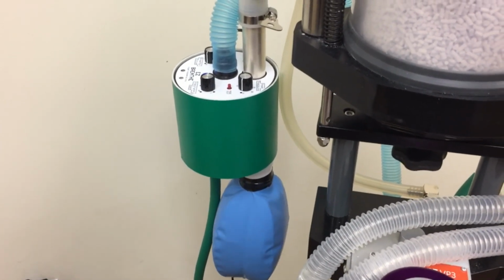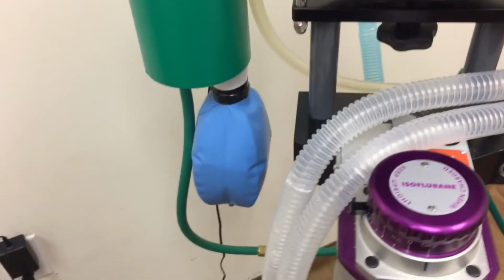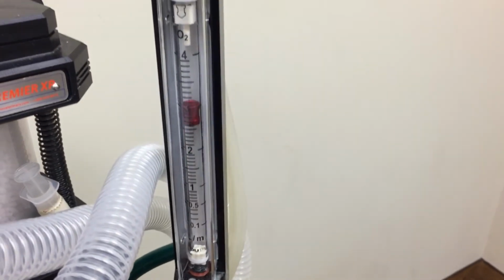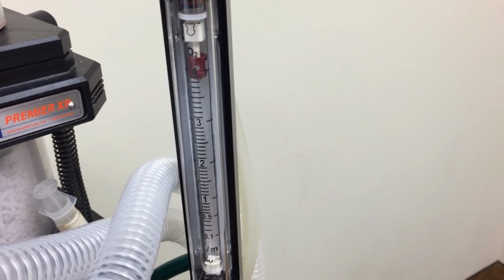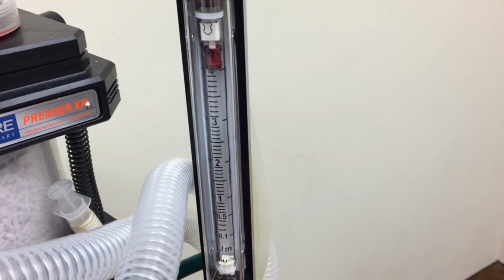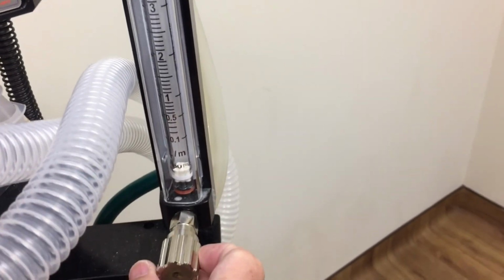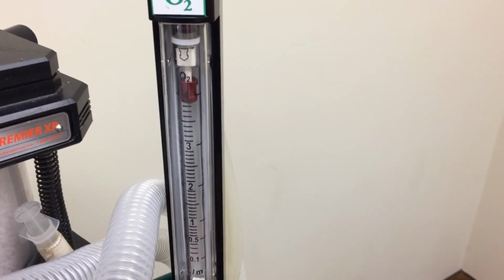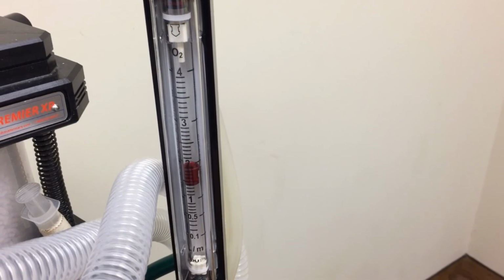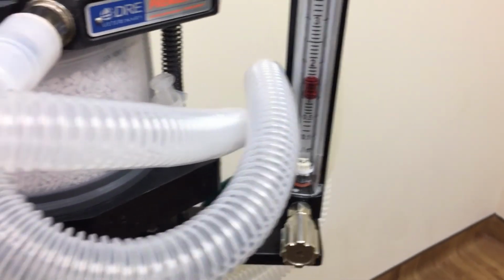In summary, if you hear the low pressure or disconnect alarm, check to be sure that the patient is connected. If the patient is, turn the flow meter up to fill the bag. Just be sure you don't turn it up too high. If you turn it up so high that the pressure is too high, you will hear a pressure alarm and the ventilator will stop cycling. If you lower it back down, the pressure will come down and it will resume cycling.